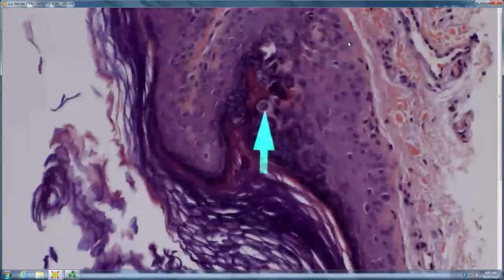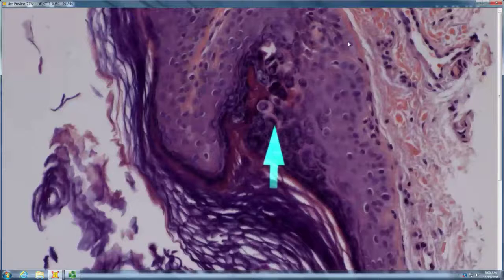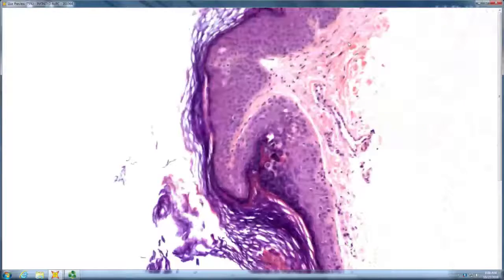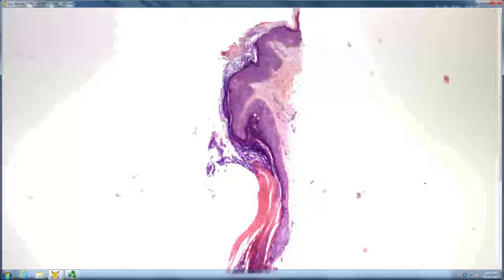Here, what do you have? With a nucleus and a blue ring, and then a clear ring around that, and another blue ring. Is that like Grover's? Yeah, acantholytic dyskeratosis, and if this is a solitary lesion, it's a warty dyskeratoma.